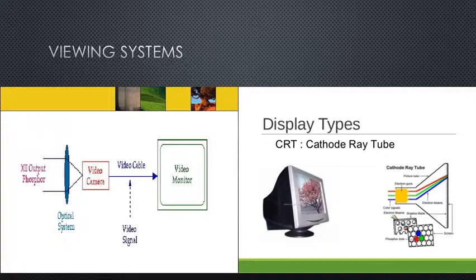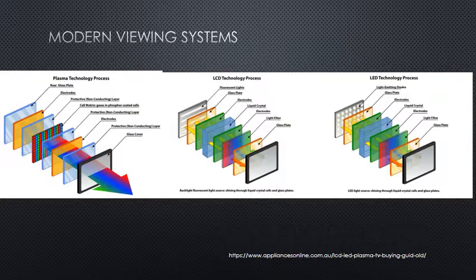There's really nothing very magical about this process. It's very simple. We talk about it in digital imaging all the time. There are different kinds of monitors: CRT, cathode ray tube, and LCD. These are some examples of that with some more details on the layers. You really just need to know what LCD stands for and recognize that.